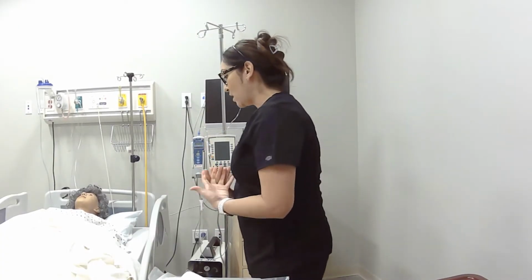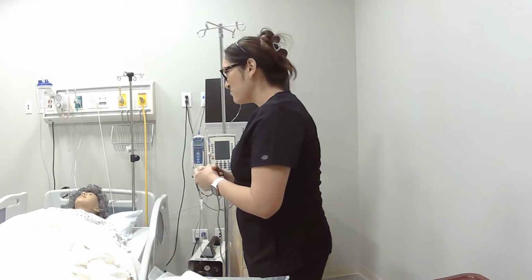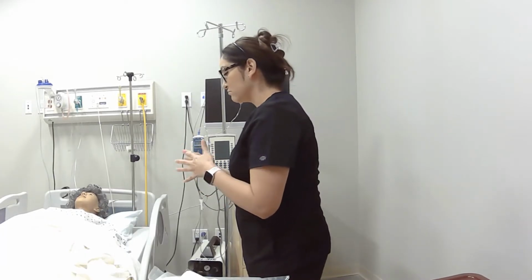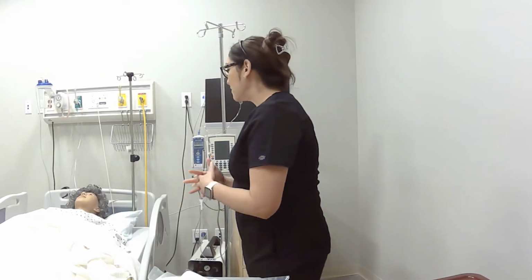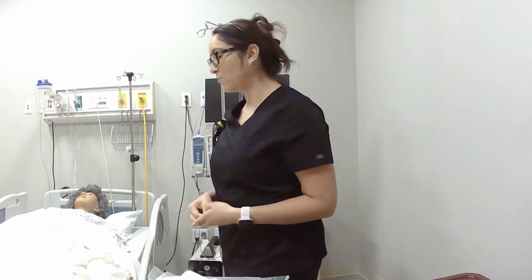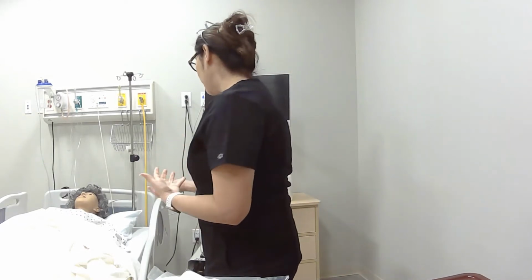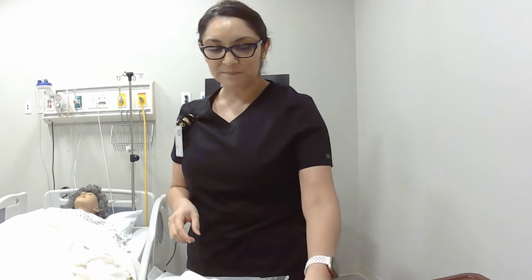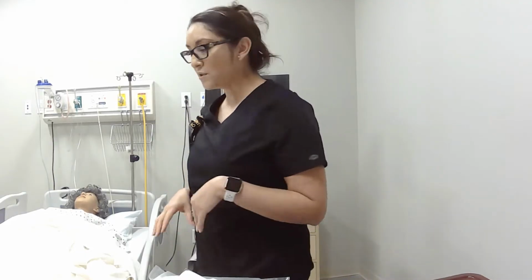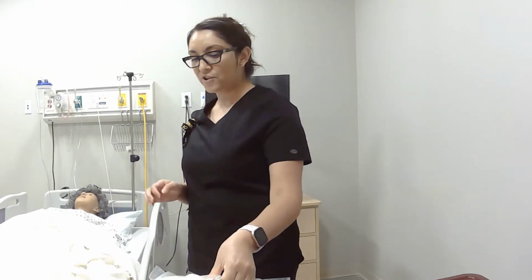Alright, so yes, I'll be cleaning your perineal area and just making sure that we're removing any flora, any debris, also making sure that you haven't had a bowel movement, and we'll clean you off first, so that way we're not introducing that bacteria into your urethra, which is a sterile environment. Okay, so we'll be doing that first, and then I'm going to be inserting the Foley.